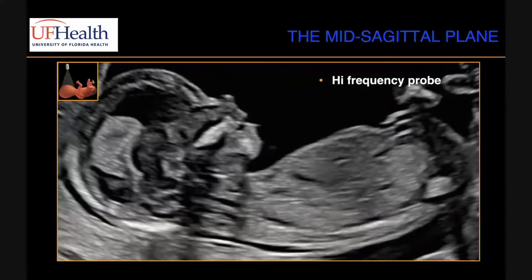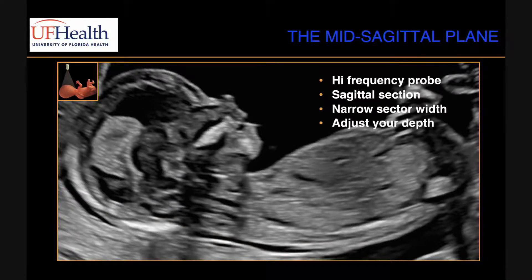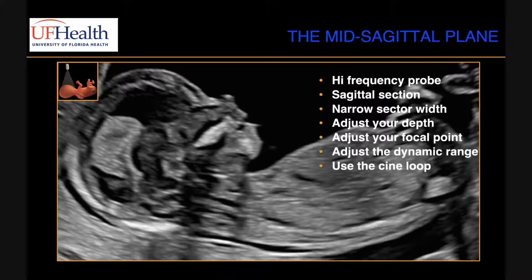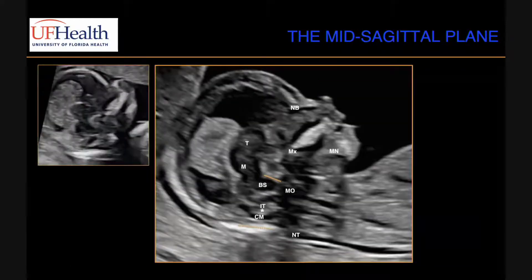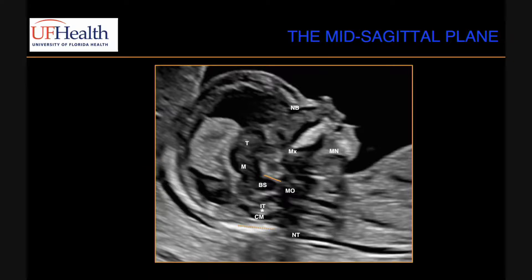To get to this midsagittal plane, you need a high-frequency probe, get your sagittal section, narrow your sector width, adjust your depth, adjust the focal point, adjust the dynamic range, and use CineLoop. Be very mindful, because a lot of times when looking at NTs and midsagittal images, sonographers say an image looks midsagittal, but you should never have a connection between the maxilla and the nasal bone — that's the frontal process. If you do, you're a little parasagittal, and you need to slide the probe parasagittally until that disappears completely.